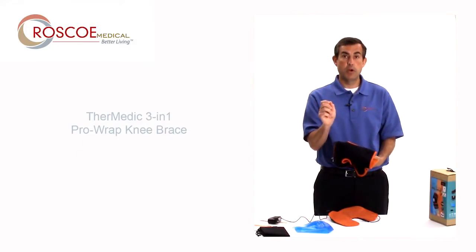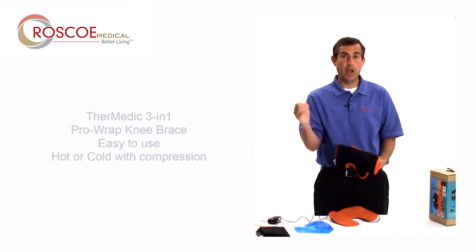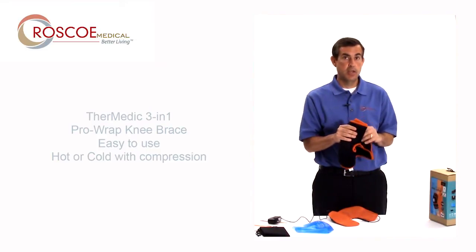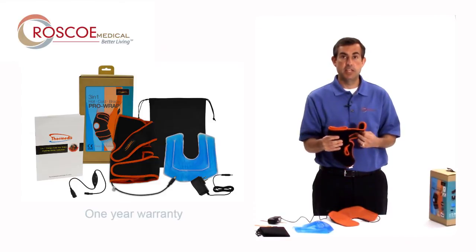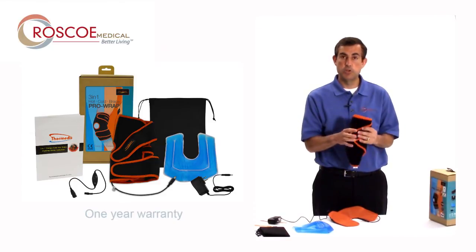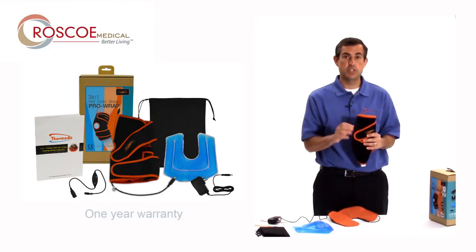Again, this is the Thermetic 3-in-1 — easy to use heat or ice with compression. You're going to get a lot of great years out of this. It's a one-year warranty from Roscoe Medical and your authorized dealer. Please enjoy this and call us or your dealer with any questions at all.